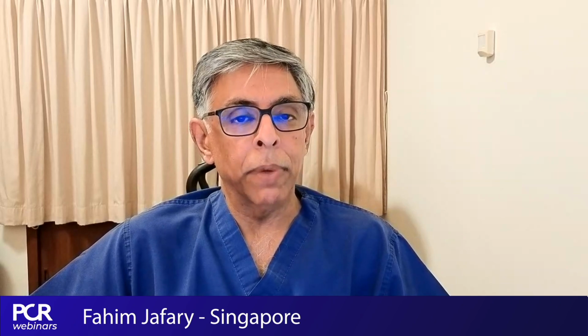I think the case is obviously an isolated circumflex, where the patient ideally has a soft lesion that would respond well to a cutting balloon. Although I think that if you have a calcific lesion, and now with IVL, we seem to be getting pretty good ostial results. So those would be the main subset of patients where I would offer this.